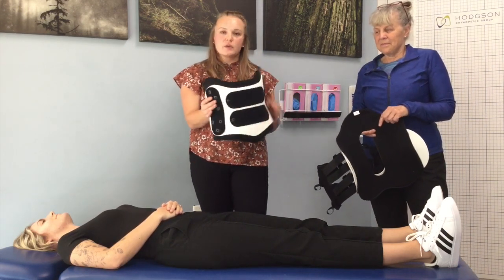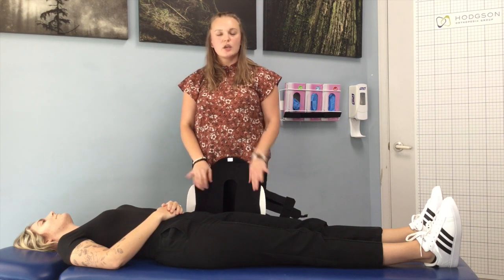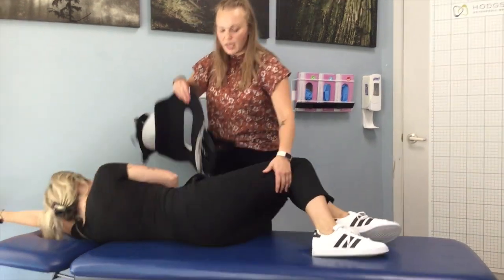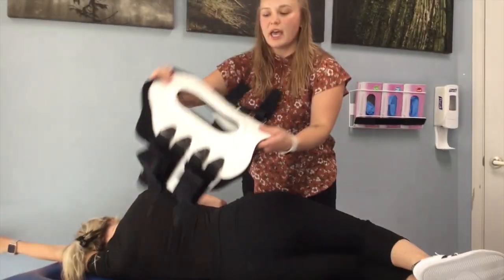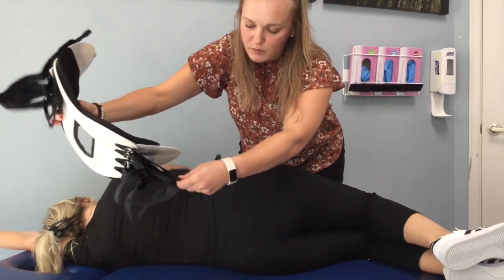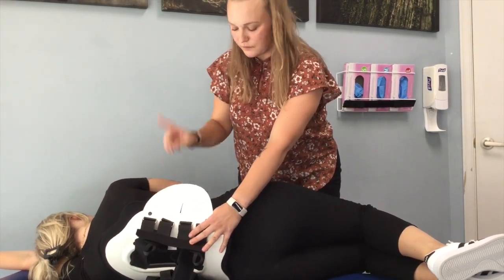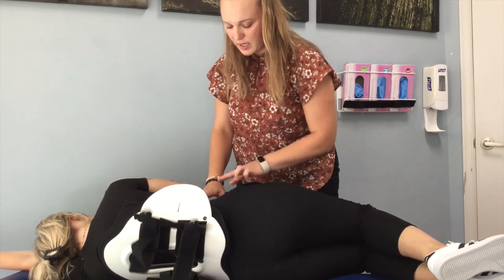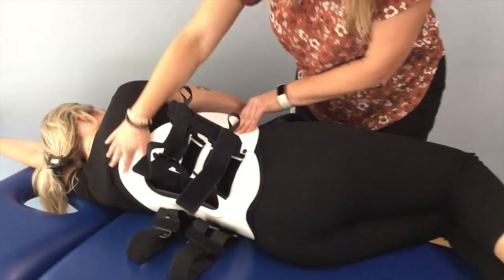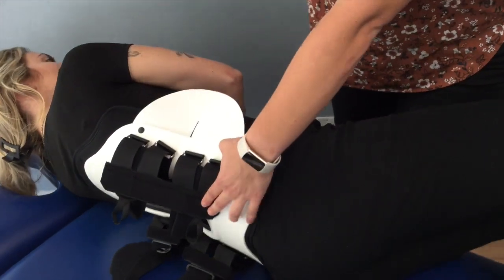Our patient is going to log roll towards me, and we want to do this in a safe manner. Depending on how your patient is injured and what jurisdiction you're working in, you may need assistance. Nikki's going to bend her knees, extend an arm, and log roll towards me — I'm her safety here. We're going to ensure this is the top and this is the bottom, and we're going to line up this cutout with her spinous processes, making sure we can tuck the strapping underneath her body. We need to palpate for her ribcage — the last rib and the top of the iliac crest — and that is where this cutout is going to lie on her body.